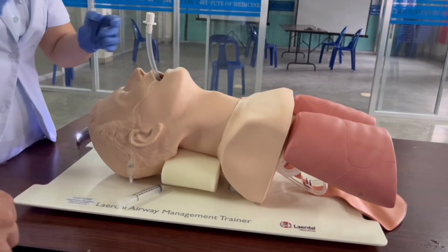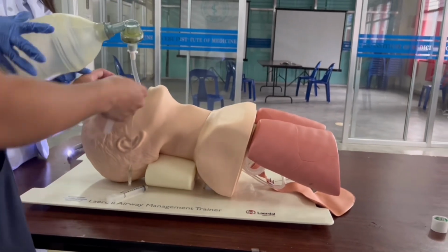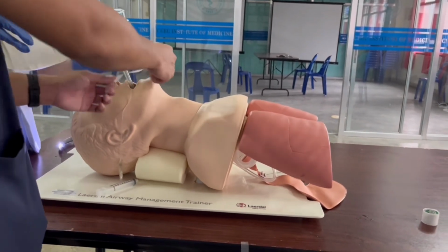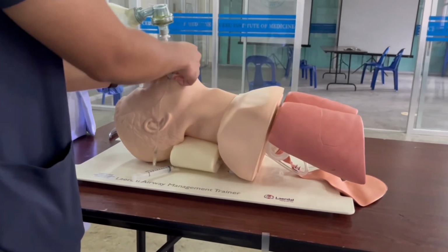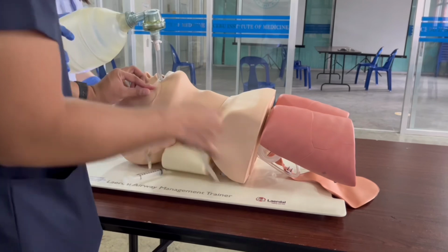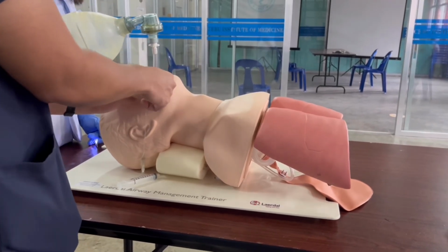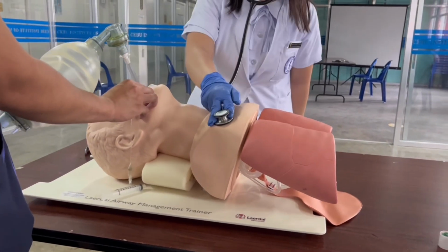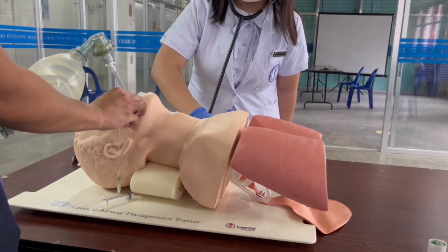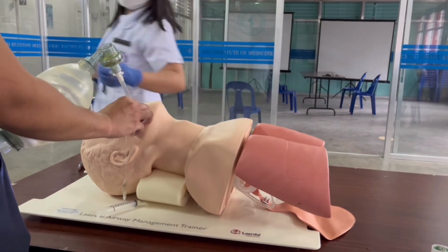Attach the tube to a bag valve mask resuscitator for oxygen. Anchoring of the ET tube by using tape. Then evaluating the placement of the tube by auscultating the chest as well as the epigastrium. Equal breath sounds must be heard over both lung fields.